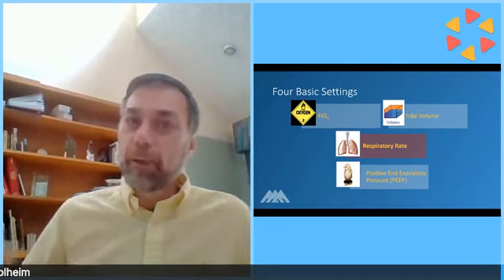So you can use it to alter CO2. Now, again, the problem with FiO2 is oxygen toxicity and nitrogen washout. The problem with tidal volume is rupturing the alveoli, especially if your patient has stiff lungs or non-compliant lungs. So that brings us to the third option, respiratory rate. Now, respiratory rate is also used to alter CO2. So if your patient's PaCO2 is altered, then you're going to play with the respiratory rate.